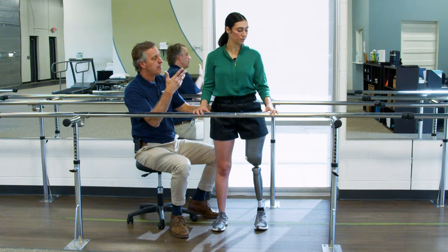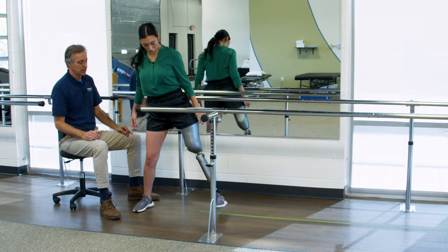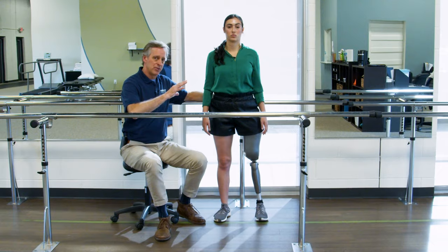All right, so she's there, and all she's going to do is step. There you go. And as soon as that foot comes down, move over. And then head back the other direction. Step, step, step, step, step, and come back. Perfect.